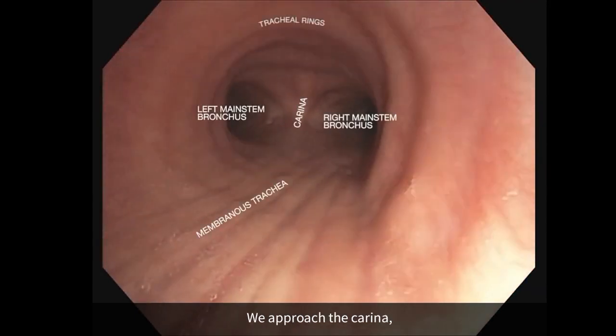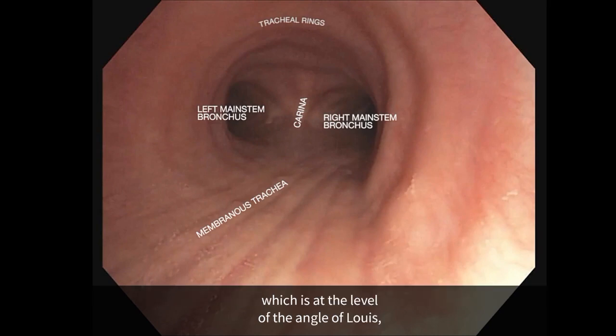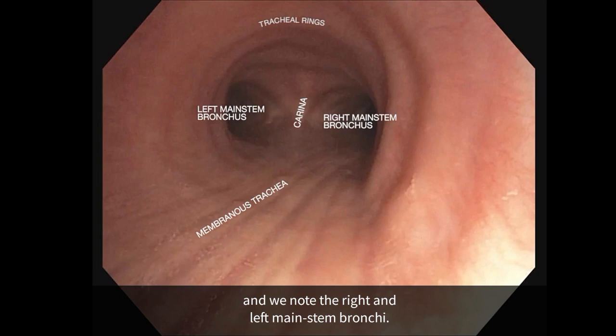We approach the carina, which is at the level of the angle of Louis, and we note the right and left mainstem bronchi.